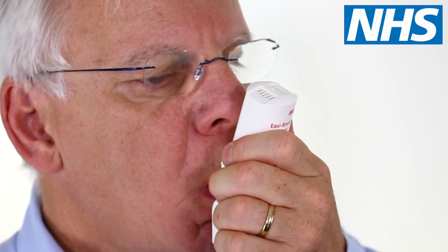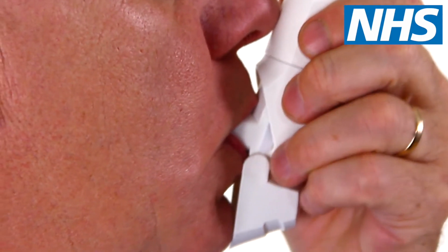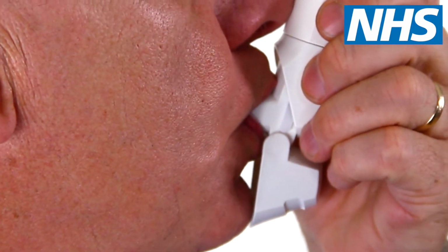Now place the mouthpiece into your mouth and between your teeth, but don't bite down on it. Close your lips around the mouthpiece to form a tight seal. Make sure the inhaler is upright and that your fingers are not covering the air vent at the top.